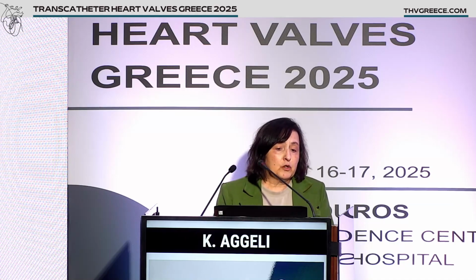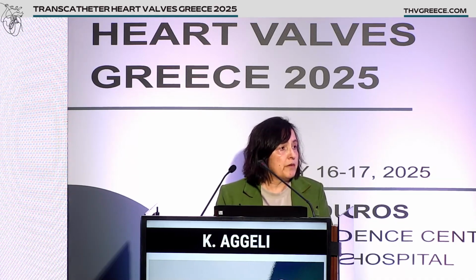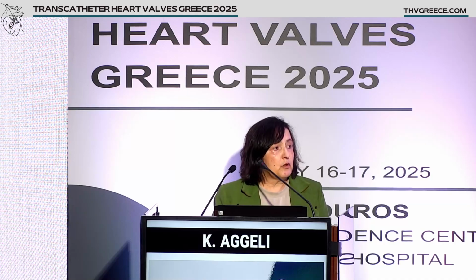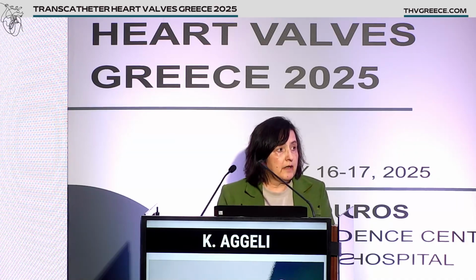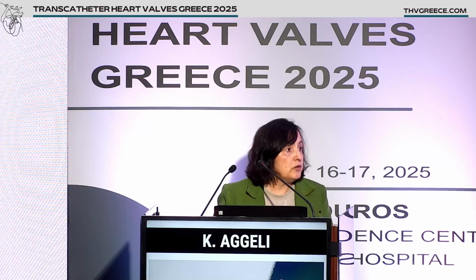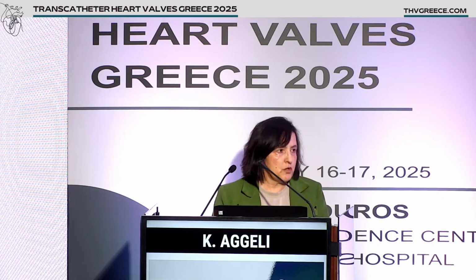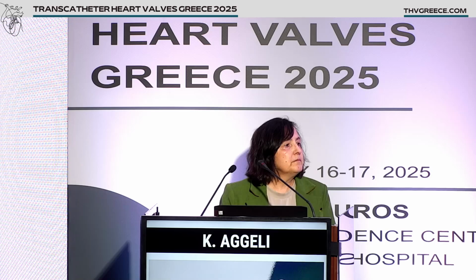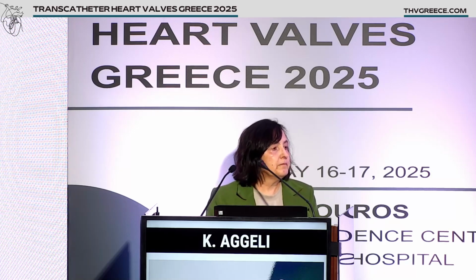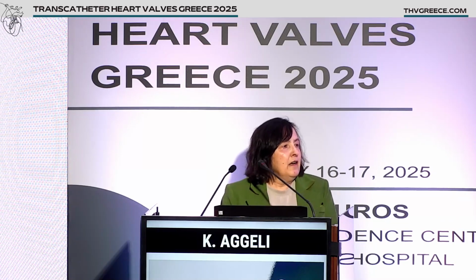According to the previous question, I think that we proceed to the EVOQUE implantation in patients with good right ventricular function. We need to have good right ventricular function with a good right ventricular reserve, and it's not necessary for the TEER procedure. I was intrigued by your last two slides about AI involvement in the diagnosis and treatment of tricuspid regurgitation. Would you like to add anything more?